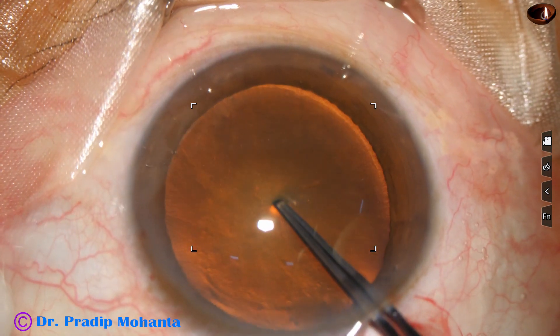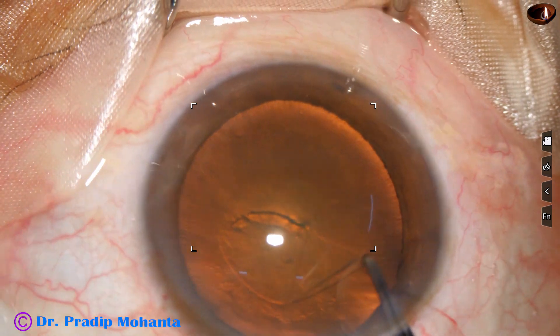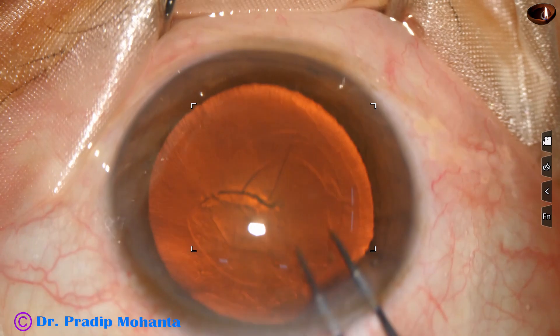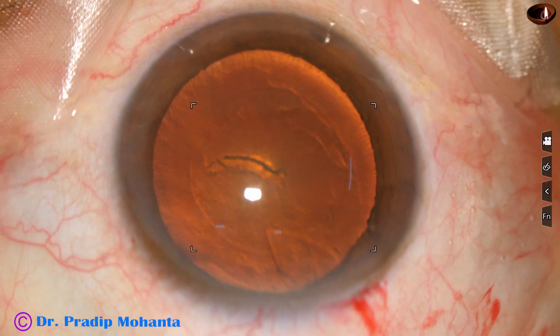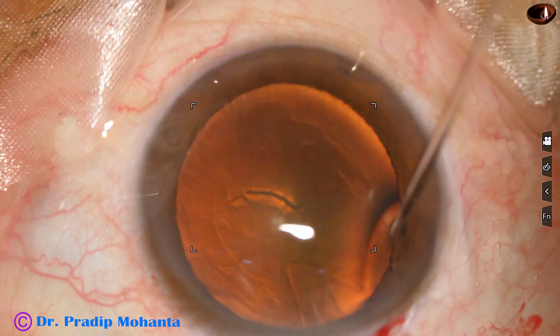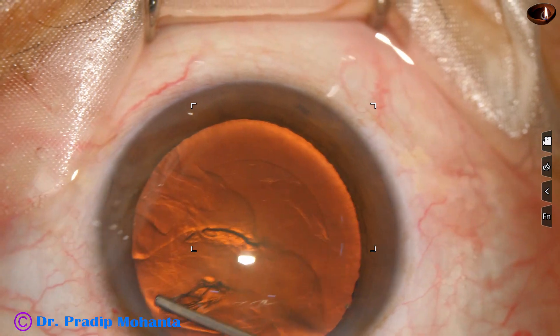Capsulorhexis is being done with the help of utrata forceps. The utrata pierces the central part of the capsule, a capsular tag is raised, and this capsular tag is guided to achieve a 5.5 mm capsulorhexis. Hydrodissection is then done.